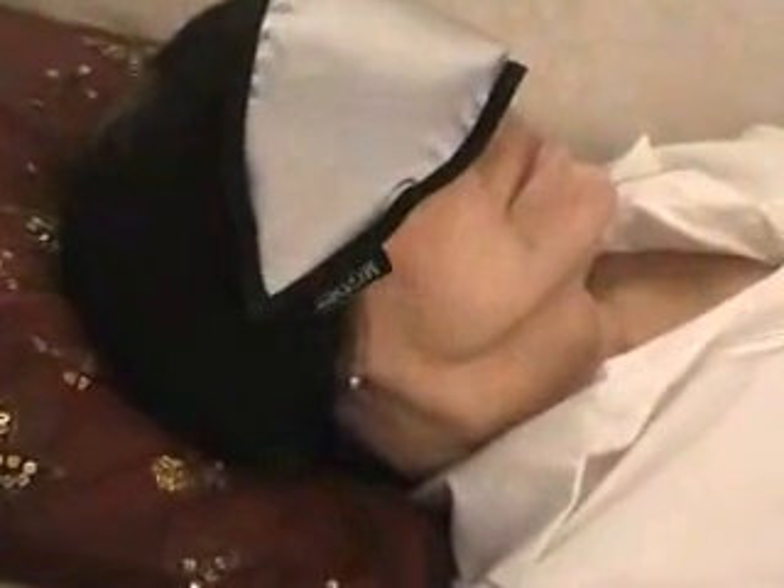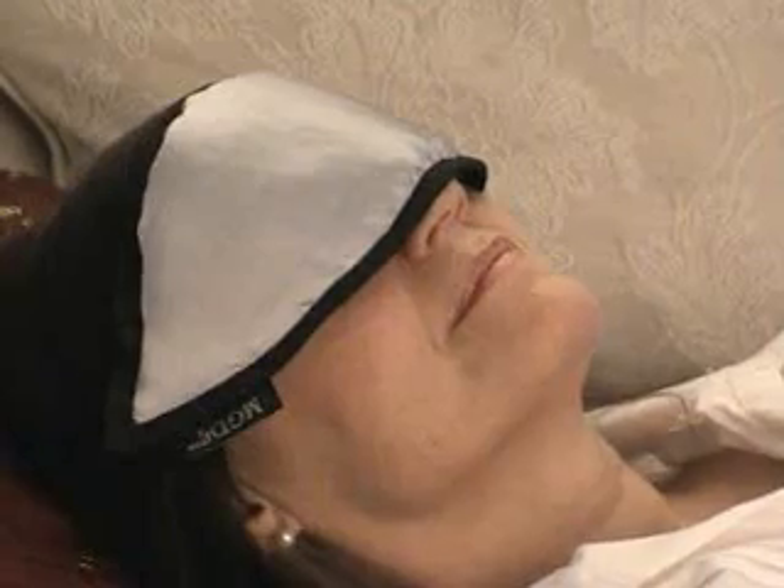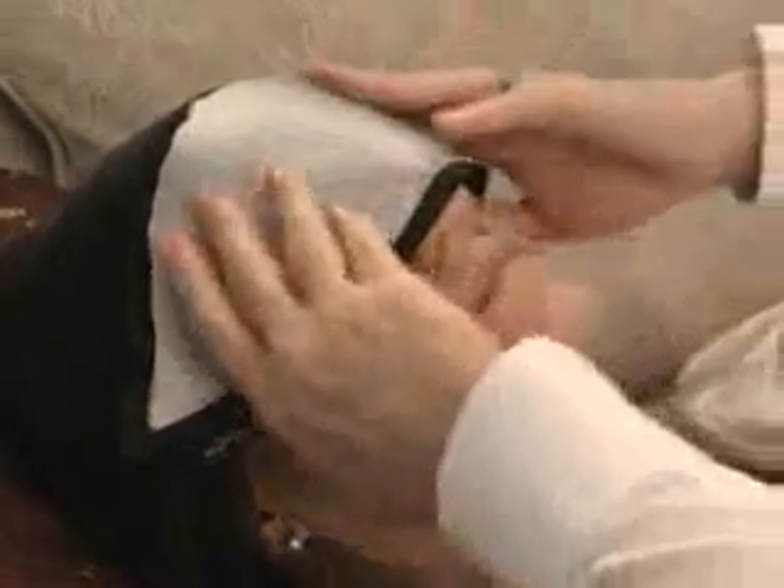Relax with the eye bag over your closed eyes for between 5 to 10 minutes. Immediately after you've removed the eye bag, massage your eyelids firmly using your fingertips like this.